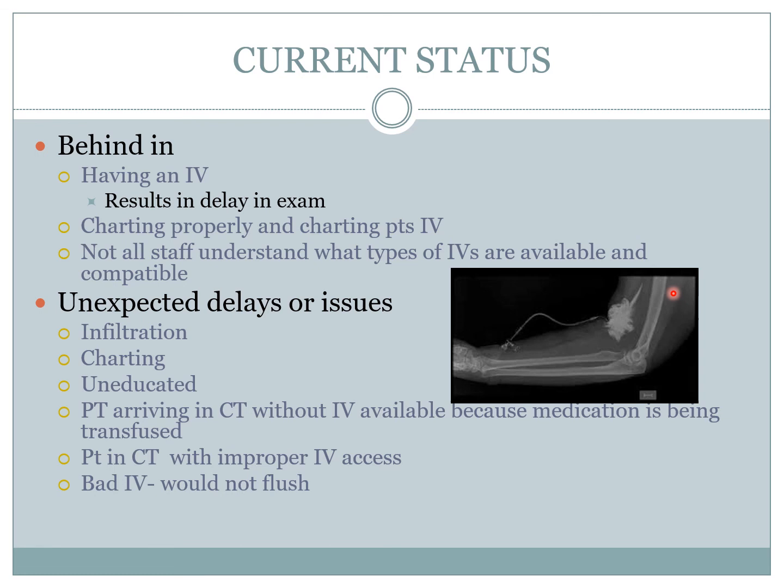And that goes for any infiltrations. It just makes sense, right? Because if there's a crash here, and this is the highway, this is the freeway, and you want to get through to your destination, let's say the heart, and there's traffic, you're not going to go through where there's a car accident.